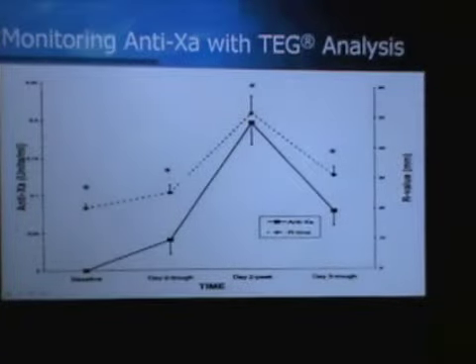So the heparinase will take out the Lovenox, show you where they're at with no Lovenox on board, and the plain cup will show you where they're at with the Lovenox on board. So your heparinase is your control, which is really cool. So for Lovenox, we can order a TEG after we treat the patients? Yeah. And if it's normal, we continue the same dose, we don't have to do anything extra.